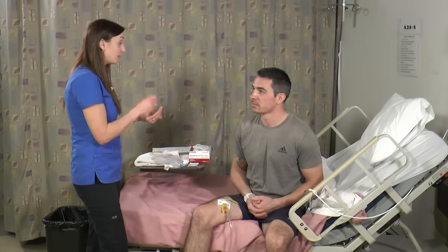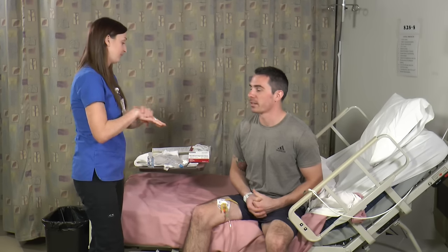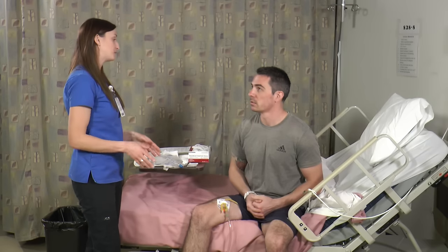All right, can you tell me your name and your date of birth? Sure. George Miller, January 20th, 1961. All right, let me take a look. Why are you nurses always asking me that? Because we need to clarify every time that we have the correct patient.